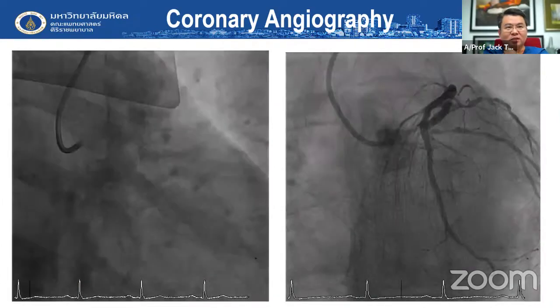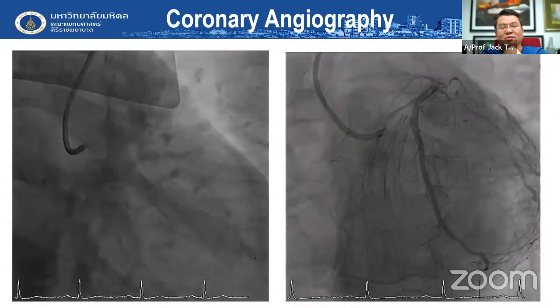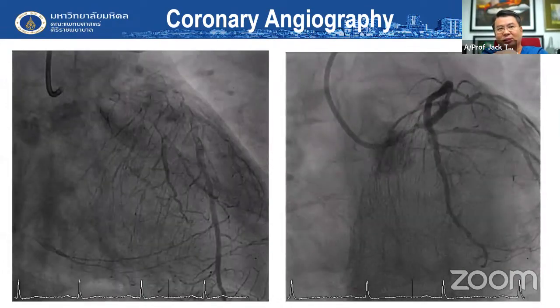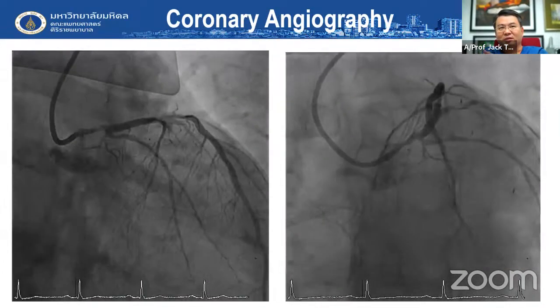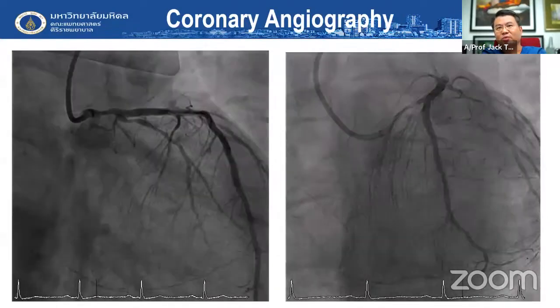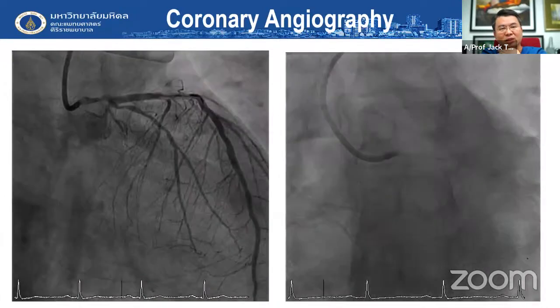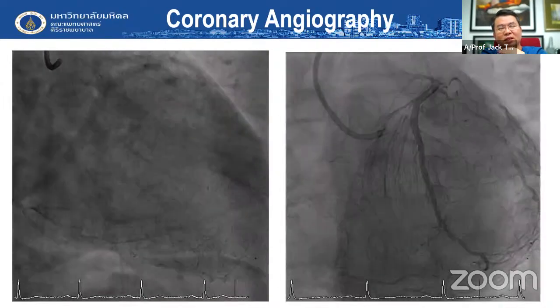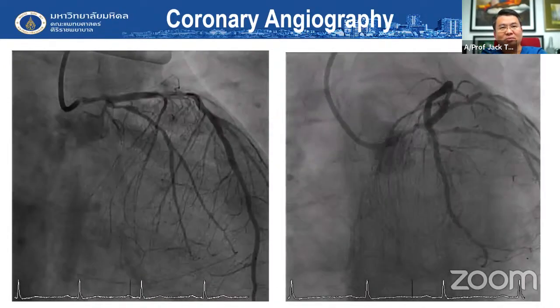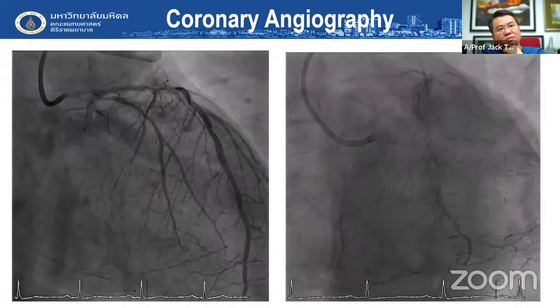Thanks for those comments. Sydney, maybe we go to you. A few things were brought up. We all agree that this diabetic patient with triple vessel disease and left main with poor EF should be a surgical case. I think we should push this as a class one. If we were to approach PCI, would you attempt the left main to start? And is MCS support needed or not needed for this case?